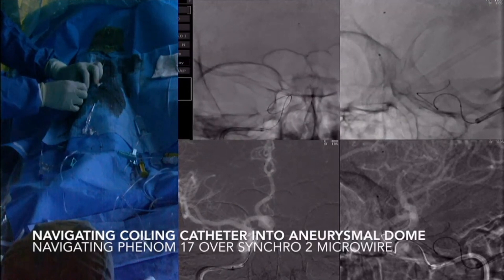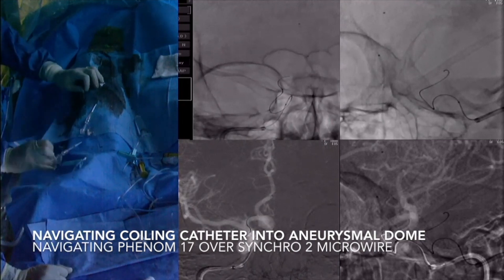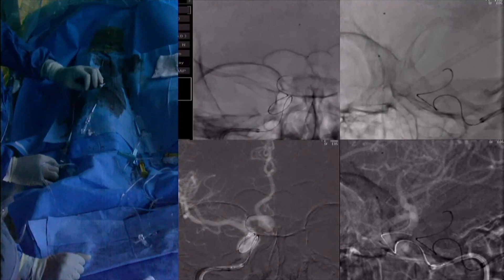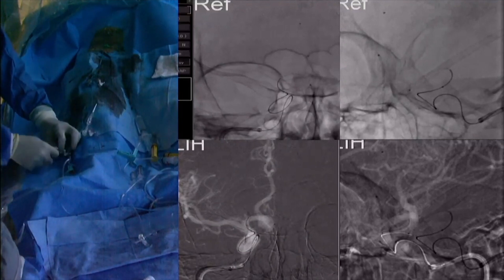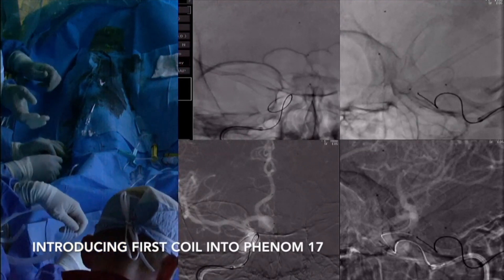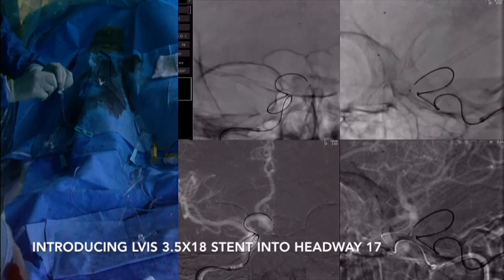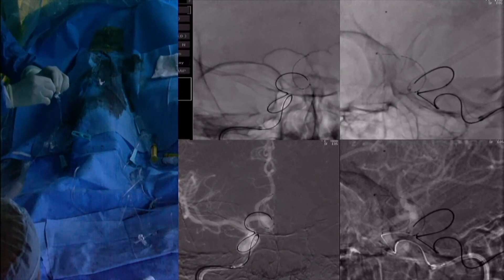Here we see the wire and a second microcatheter being brought into the aneurysm. Here is a stent being navigated in the microcatheter around the aneurysm, being placed into the A2 segment.